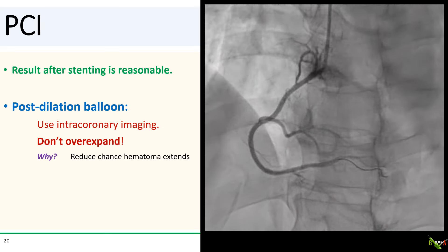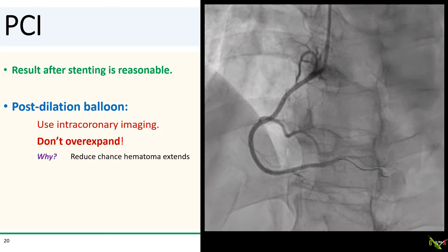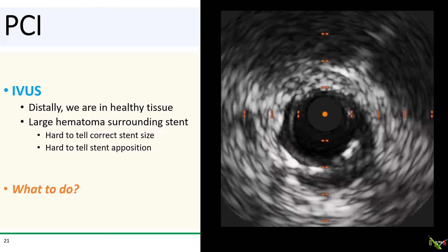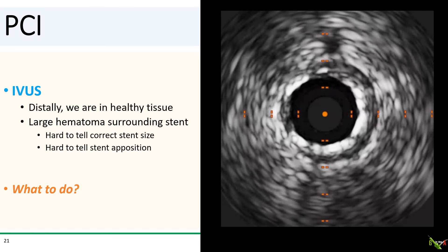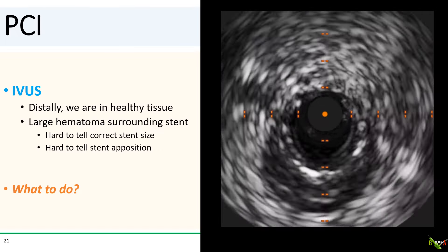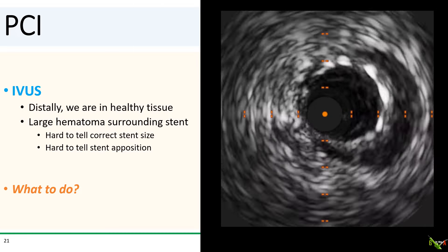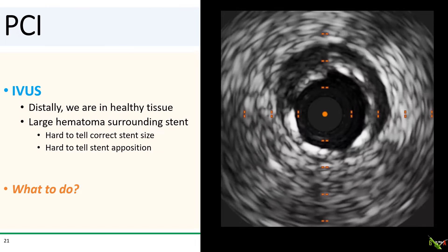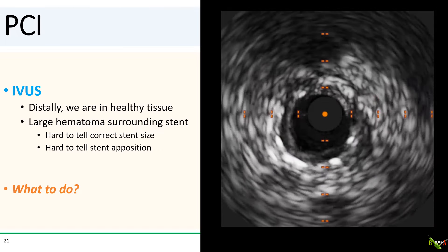So I will almost always reach for intracoronary imaging, but even that doesn't always help. We did IVUS, and here is part of the IVUS run. Distally, you can see that the stent is well-sized and well-opposed and that we seem to be in healthy tissue. But as the IVUS pulls back, you'll start seeing a dark echo-free area around the stent — initially on one side, and then eventually circumferentially all around the stent. This would normally look like a massively undersized and under-expanded stent. For this patient, it is probably the intramural hematoma from the SCAD that we're seeing, and it was tough for me to tell whether my stent was well-opposed or not within that segment.